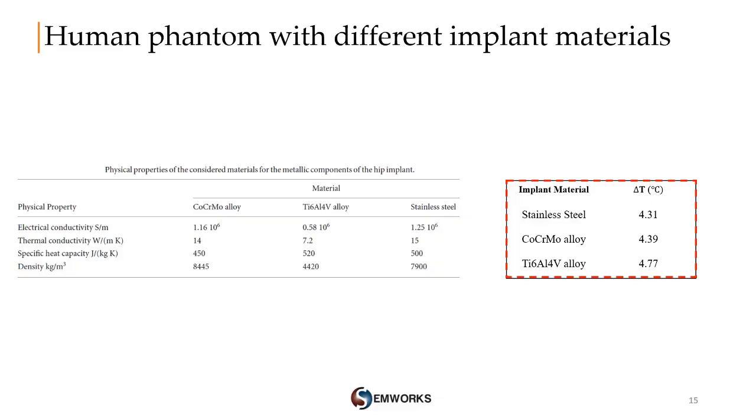We changed the implant material to the most used materials for this kind of medical device, and we tried to check its effect on the RF heating rate inside the phantom. So, as you can see, the temperature rise is always bigger than 4 degrees Celsius for the three selected metallic materials: the stainless steel, the cobalt alloy and the titanium.